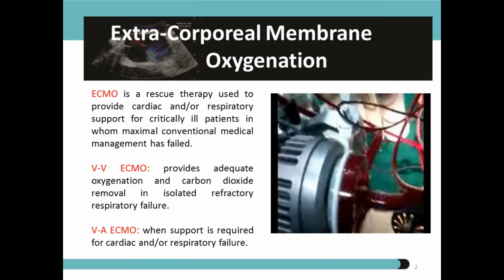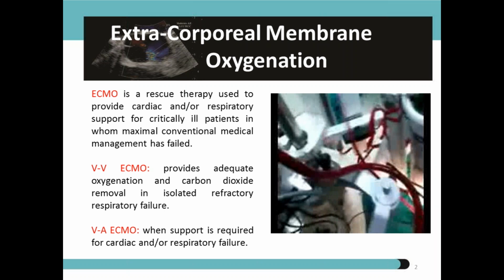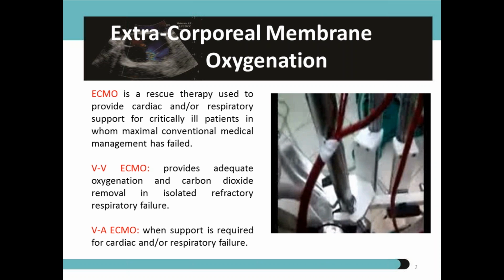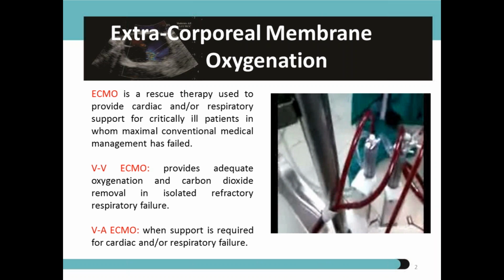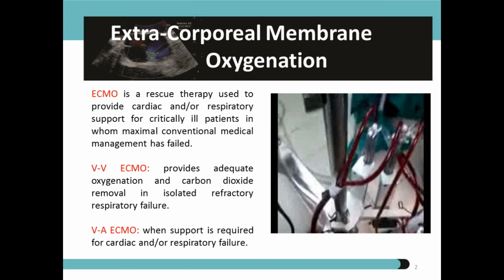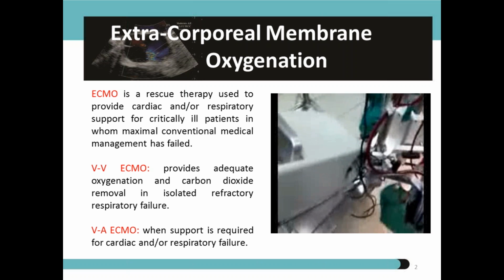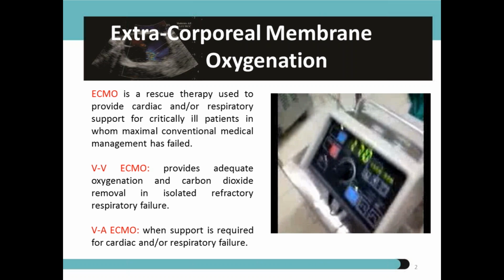This is the centrifugal pump. We used a bladder, an ancient one at that time, and our arterial and venous lines of the ECMO you're seeing. And we used to take away the whole machine of the centrifugal pump being used at that time, along with the patient while on ECMO. This is a VA ECMO being done in a patient for arterial switch operation.